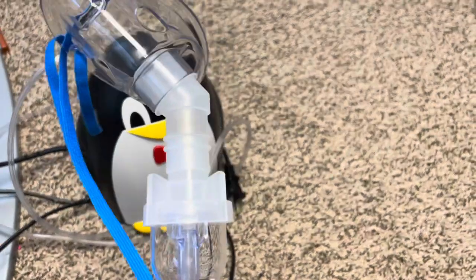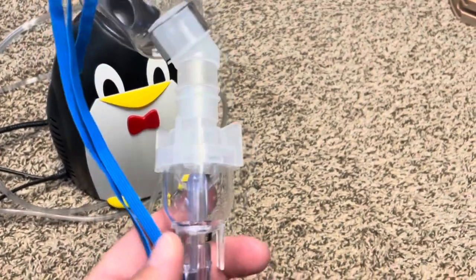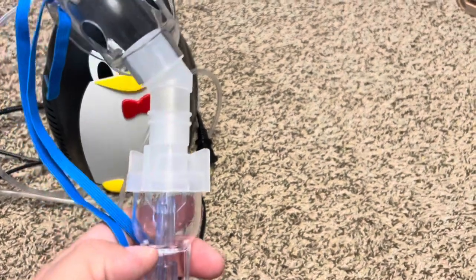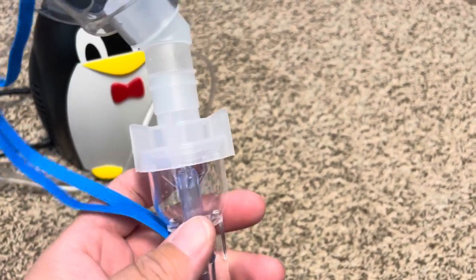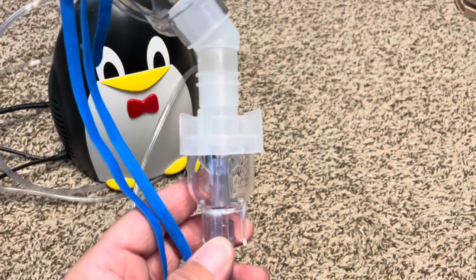I'm the kind of mom who sterilizes everything, especially since my son has an airway issue. But I made the mistake of sterilizing the nebulizer parts — the tubing and mask connector. You don't want to sterilize these parts because if you do, the tubing won't fit right and it becomes really hard to get on and off.